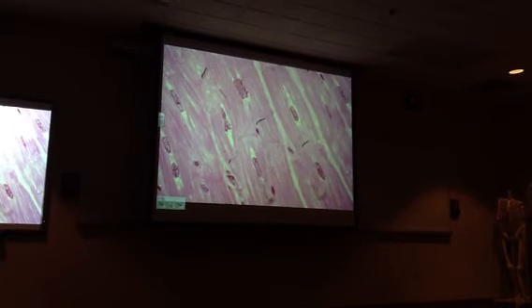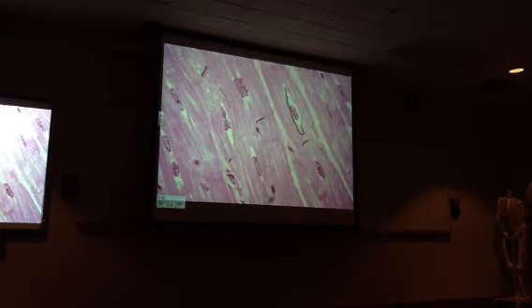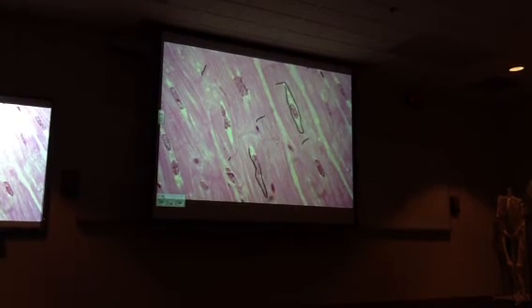Okay. Very characteristic of cardiac muscle is this perinuclear area, which in histological section often seems clear. Okay, that's where there's a lot of mitochondria and glycogen granules because these have a very high metabolic demand.